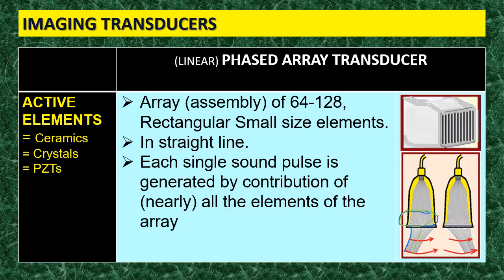How about this sound beam? Assuming that I'm having here another sound beam, all the active elements will share in the formation of each sound beam. So each one of these sound beams here is formed by what?